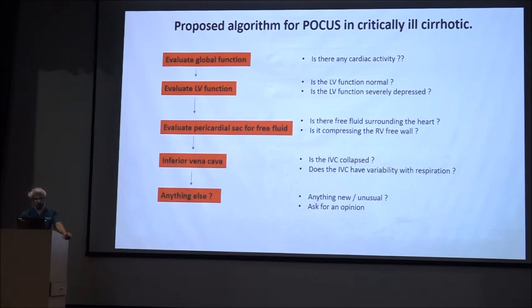The next thing will be to evaluate the IVC, whether it is collapsing or not collapsing with respiration. And always look for anything additional, that is, do you see anything new or unusual in this echo? And always ask for an opinion if you have any problems.